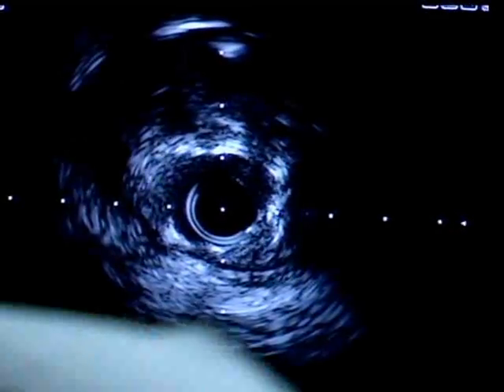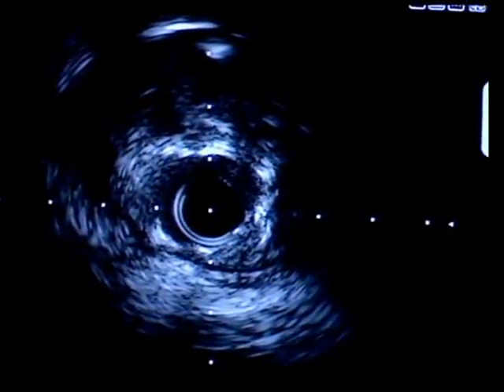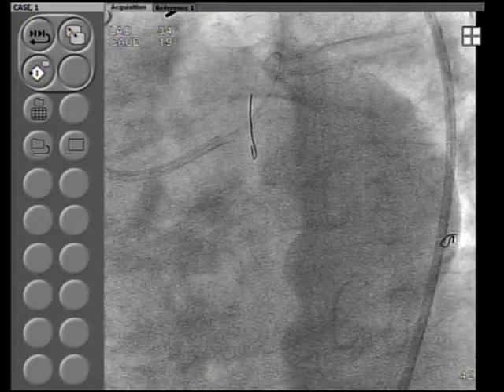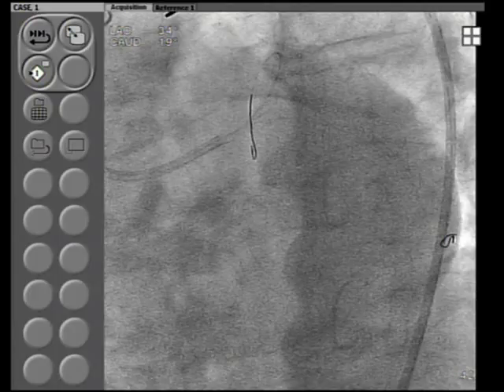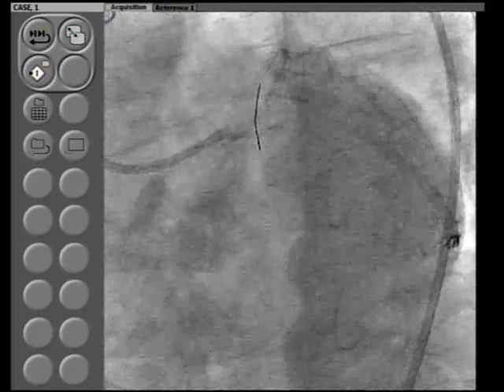Give us a 12 or 15 Quantum Maverick or NC Voyager, whichever we have, 12 and 15, same length, so that you do not worry about whether you are covering proximally. Because it has to be the proximal part, there is an overlap of the stent about 4-5 millimeters proximally, so that you are fully covered.